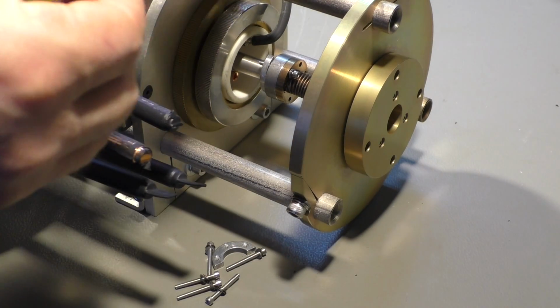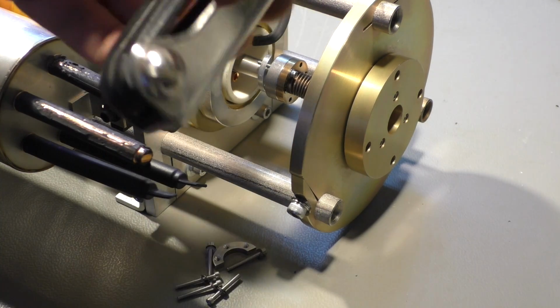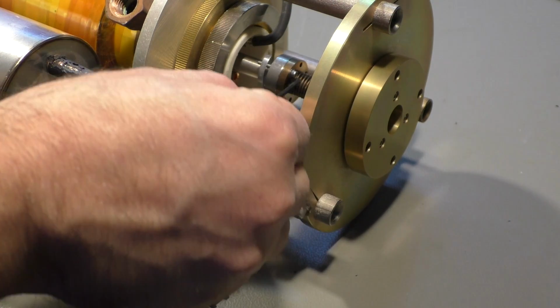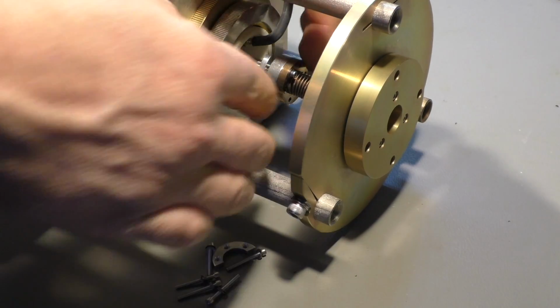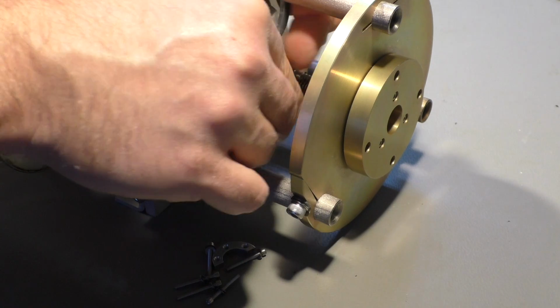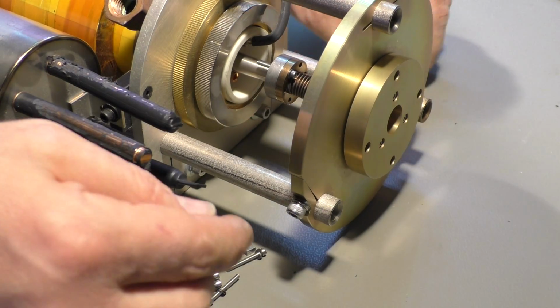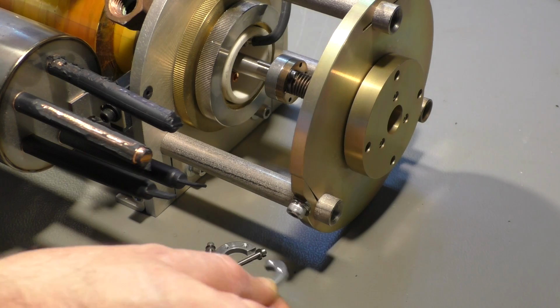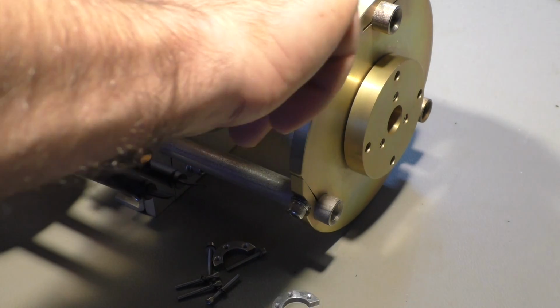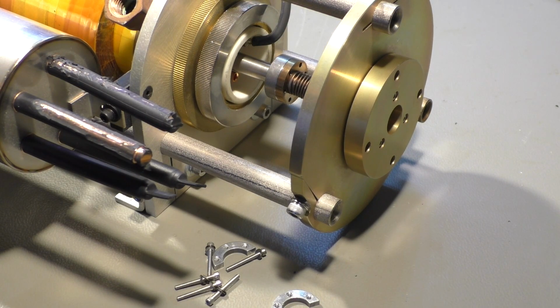I had to make myself a special tool. I only had a hex key like that, but I needed one with an angle, and that's the only one I have with non-metric sizes. I only have metric tools here, most of them, so I had no key that fitted here. You can see these half circle shaped retainers here. So this part is now loose, so I should be able to remove the rest of it.